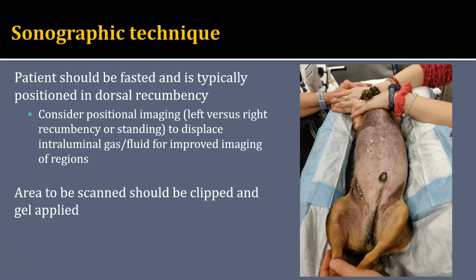First, let's talk about technique. In general, we would like to fast the patient as long as it's not medically contraindicated. That will keep our stomach empty and hopefully not very gassy.